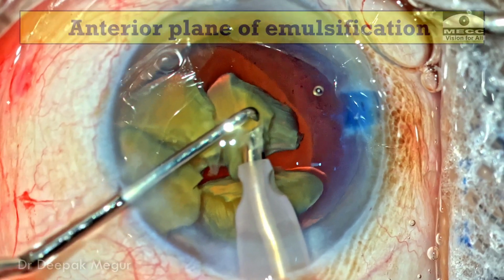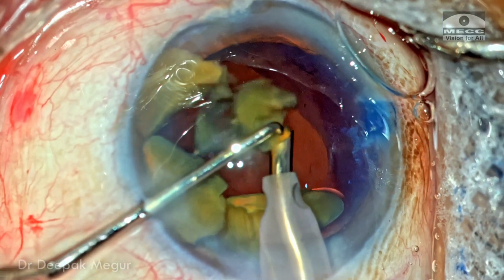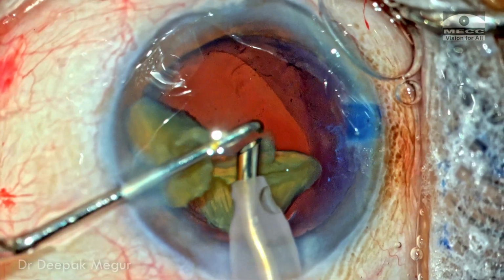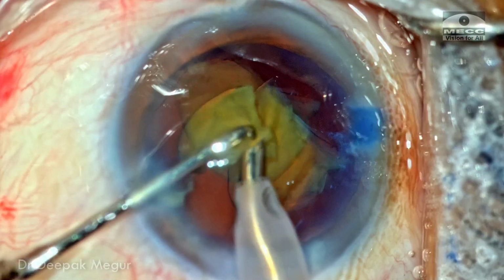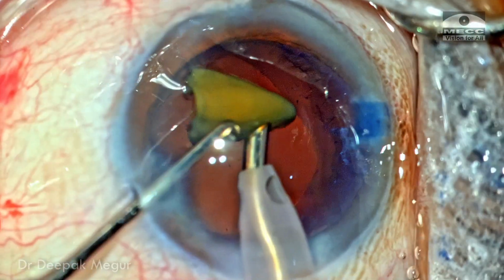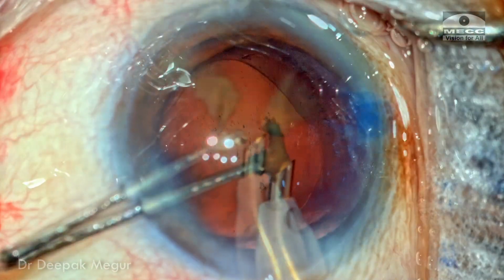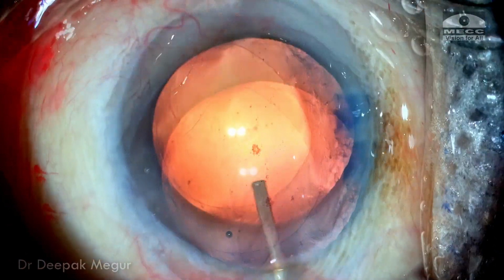So one concern is that the emulsification is all being done in the anterior chamber. So I will be concerned about the trauma to the endothelium. So I'm trying to be as slow and as controlled as possible and also as far away from the cornea as possible. But I still don't want to go anywhere near the capsular bag or inside it. Since the nucleus is not very hard and was also not very big, the nucleus emulsification was relatively easy. There's hardly any cortex, so I want to put in the lens first.